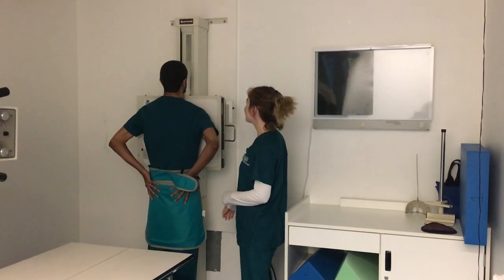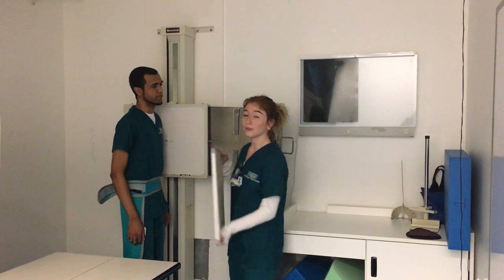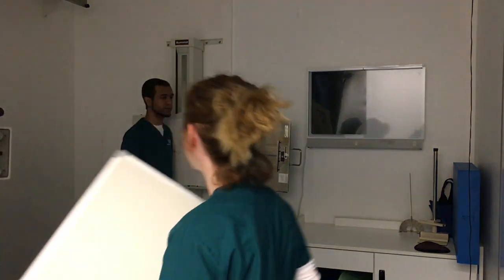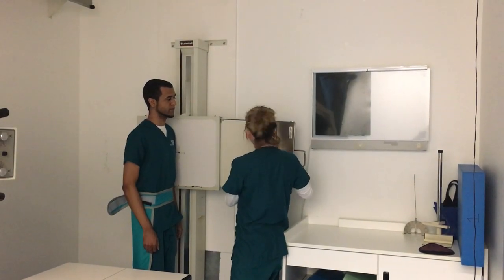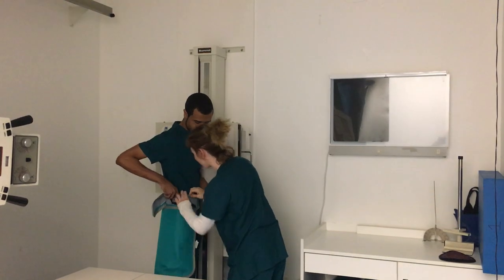I'm going to have you turn towards me. And I will change out the image receptor for a different one and take the old one out of the room so it does not get exposed anymore. Put the new one back in.